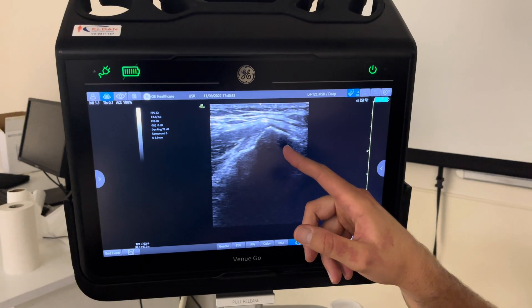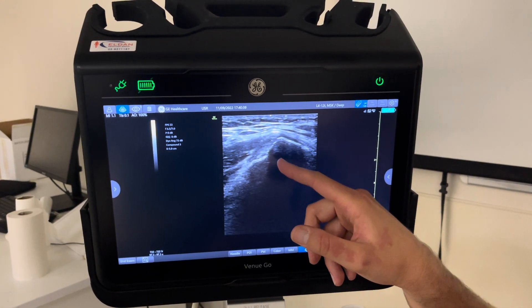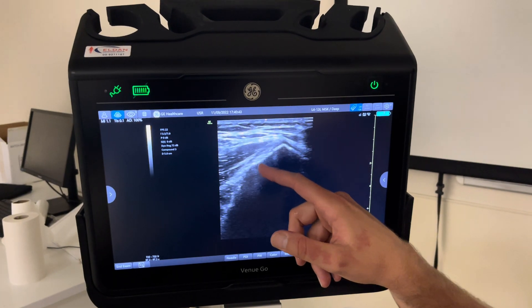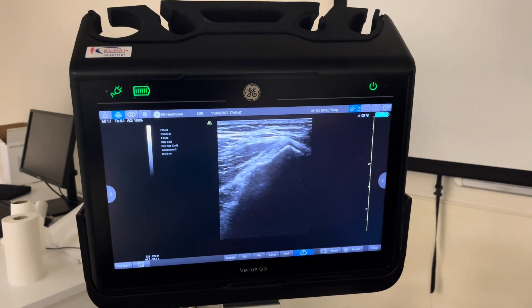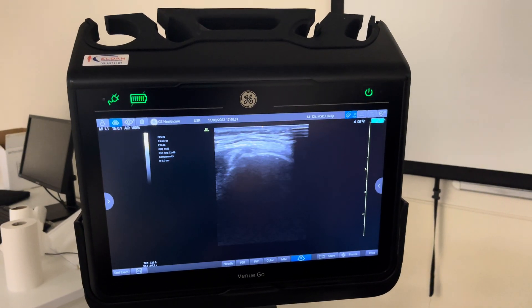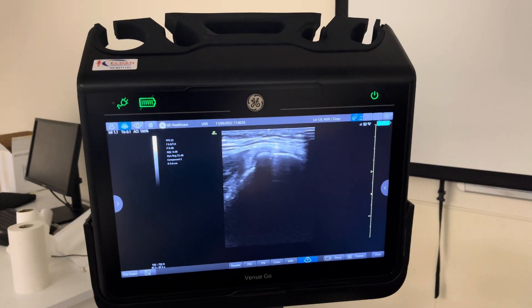In some people it's very pointy, in others it's a bit more flattened, but everybody has this point. If you go a bit further up, it disappears — so scan up to down until you see this pointy piece of bone. That's your marking. From this point, going ventral, this flat line of bone is the surface of the anterior facet. Going more lateral, this flat surface is the lateral facet.